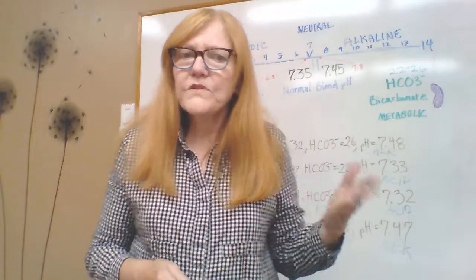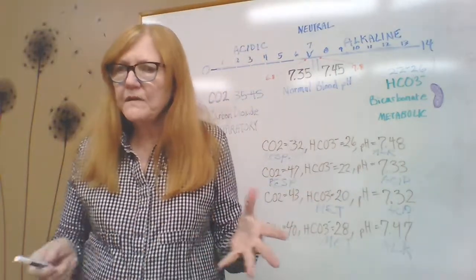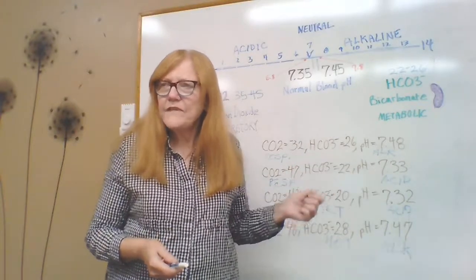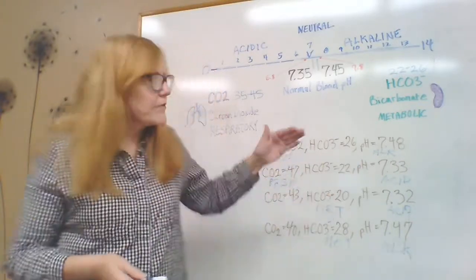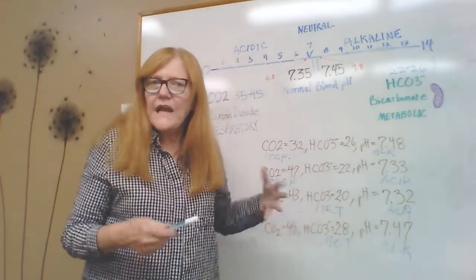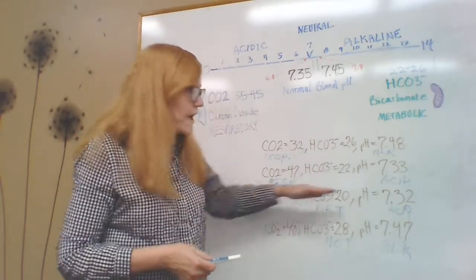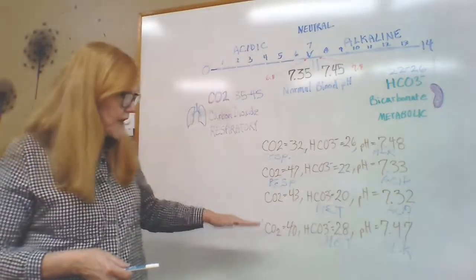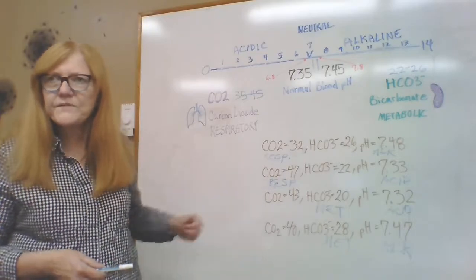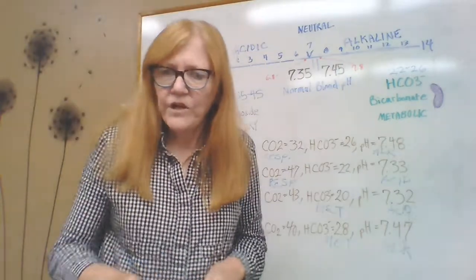Okay, well, first of all, I wanted to remind you our objectives were to recognize the normal parameters, which you did, of these ABG components, and to be able to interpret these ABG results and understand what kind of balance they're in or they're out of, and to identify when they're in metabolic alkalosis or acidosis or respiratory. So you did a very good job with that.